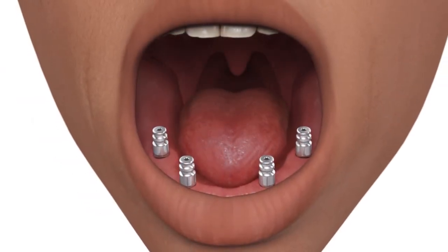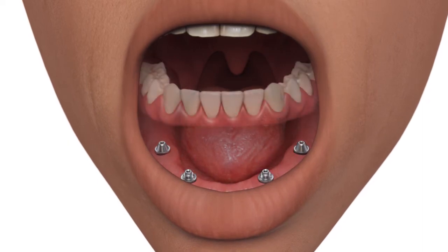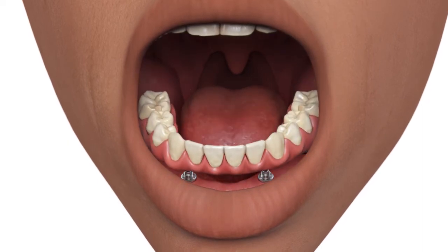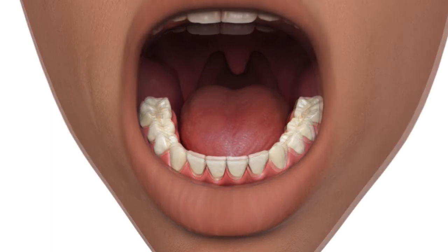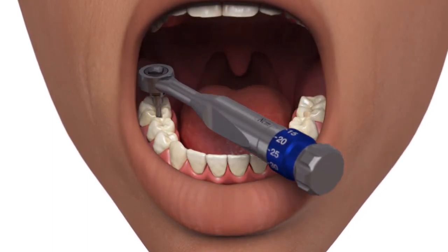Remove the indirect copings. Replace the provisional restoration. Torque the prosthetic screws to 15 Newton centimeters.